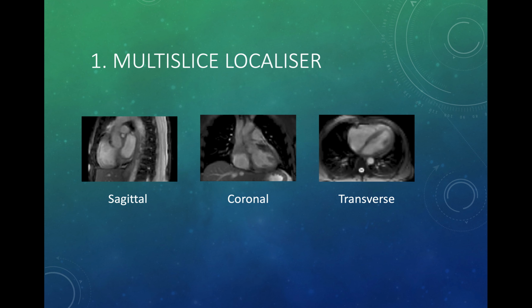And therefore we need to find a common ground to identify the position and location of the heart, a common ground between radiology and all other subspecialties and clinicians, in order to identify the position and the appearance of the heart. So let's go through how we would plan the views.